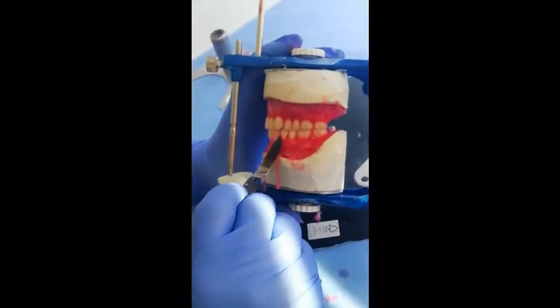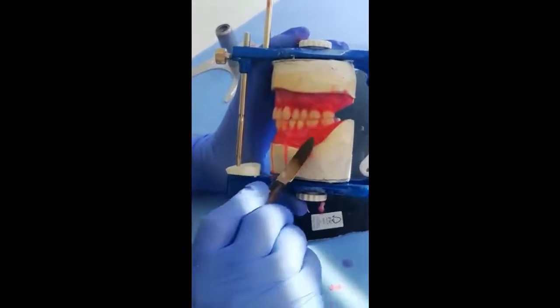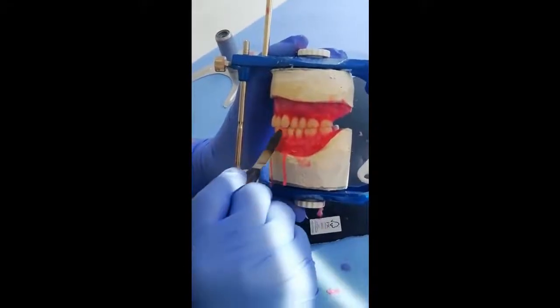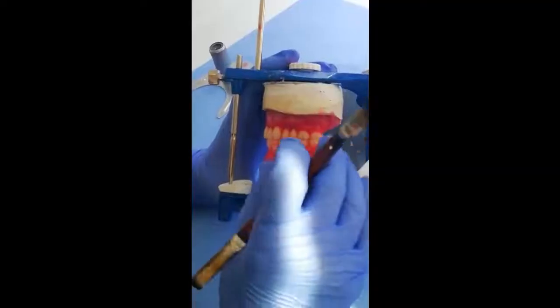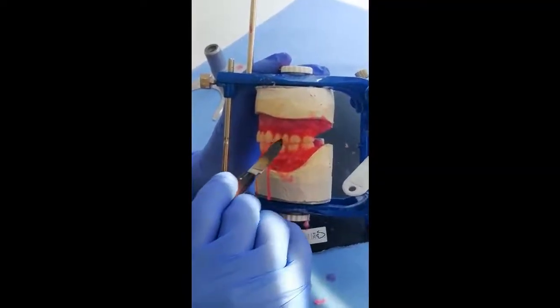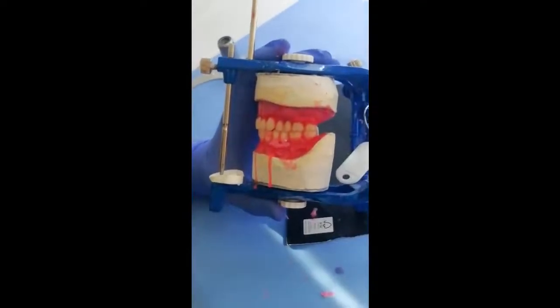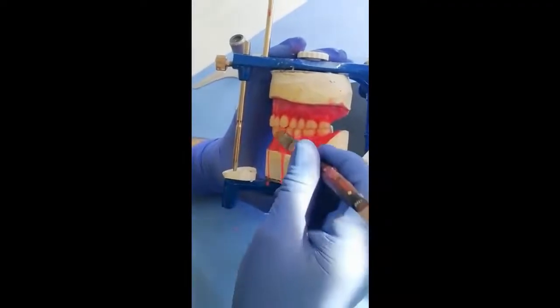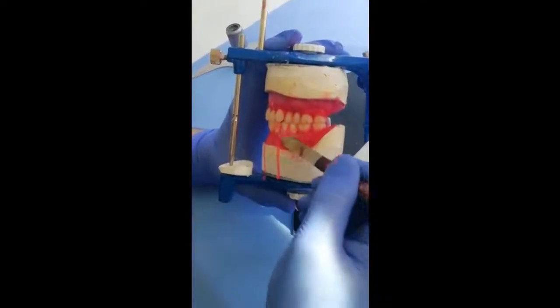We achieved now a very important part of the setting of the teeth, which is the maximum intercuspation coincident with the centric relation. Now the mandible is in centric relation with the maxilla, and the teeth are in their maximum intercuspation. Now we wait few seconds for the wax to cool down.